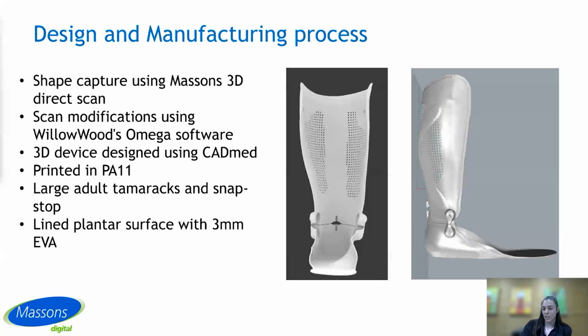attempt has an X-shaped reinforcement to give the proximal shell more stiffness while still providing sufficient ventilation and minimal added device weight. The device has been worn by the client for around 11.5 months now, with no signs of material breakdown at the joints, at the forefoot, or anywhere we would expect to see breakdown in an AFO after it's been worn repetitively for around a year.